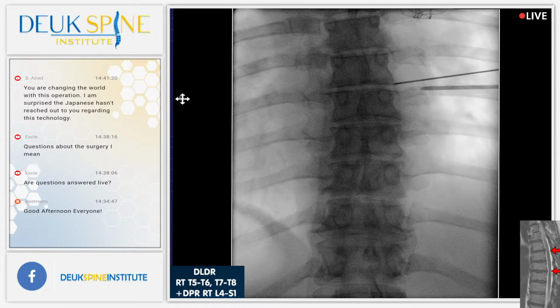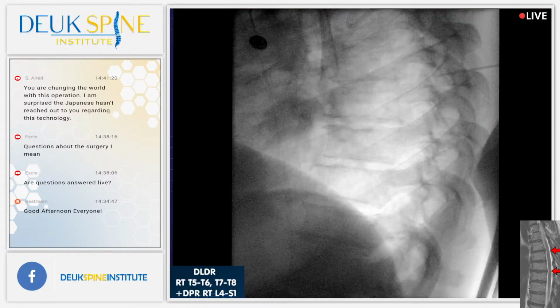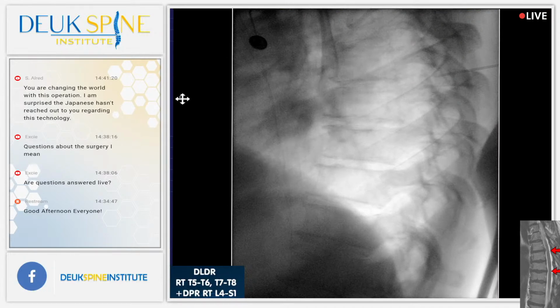Let's give her some numbing medicine. Let me get a lateral shot. No, let me do it. Just giving you a little numbing medicine, that's all. You doing all right?